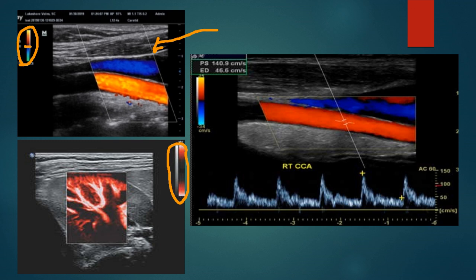And then here we have our pulse wave Doppler. So we're using our color Doppler application initially on our picture. And then when we hit pulse wave Doppler, we're going to get the scan line that pops up right here. We want to place our little addition sign right in the middle of our vessel. Once we hit update, we're going to get this beautiful waveform that's going to represent all of that blood flow in that specific area that we put that little addition sign in. From here, we're able to measure things. We're able to evaluate the behavior of the vessel in that area. So a lot of helpful information comes from pulse wave Doppler.